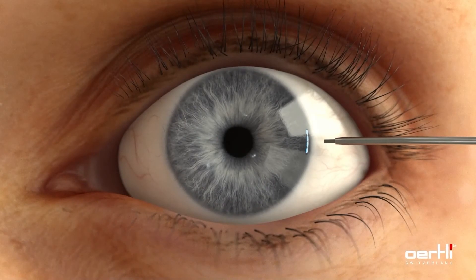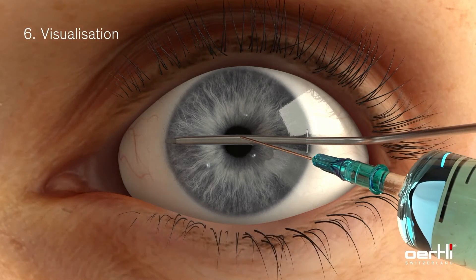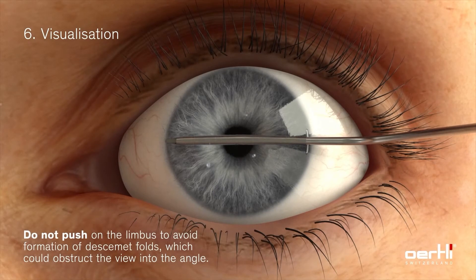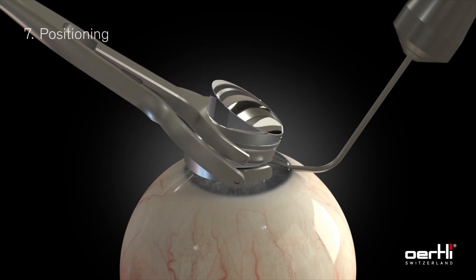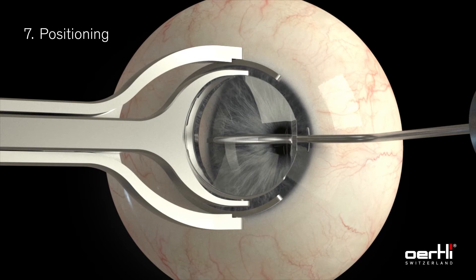The HFDS glaucoma tip is inserted through the incision and positioned at the desired point of application. For an optimal view into the iridocorneal angle, apply additional viscoelastic substance on the cornea. The gonioscopic lens is placed on the cornea, allowing visualization of the iridocorneal angle.